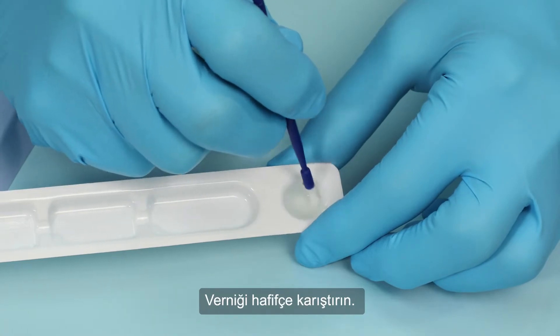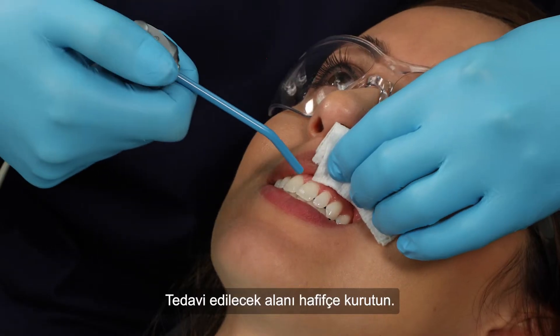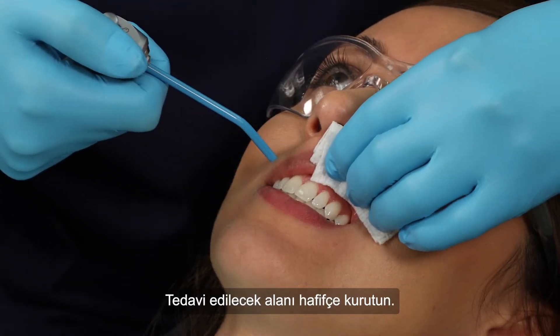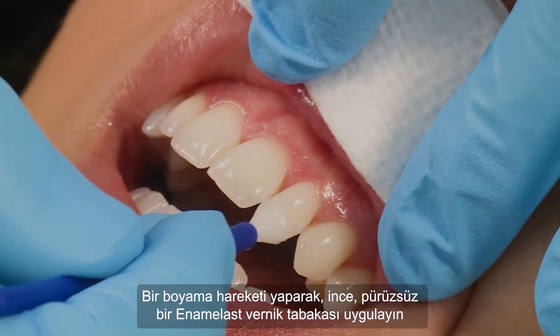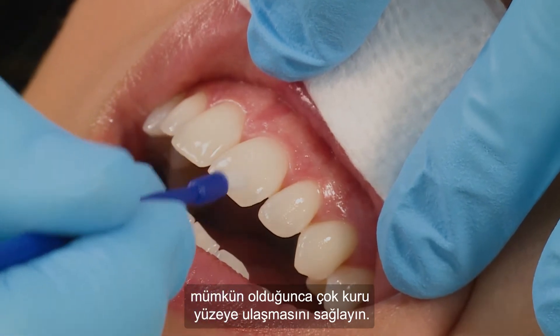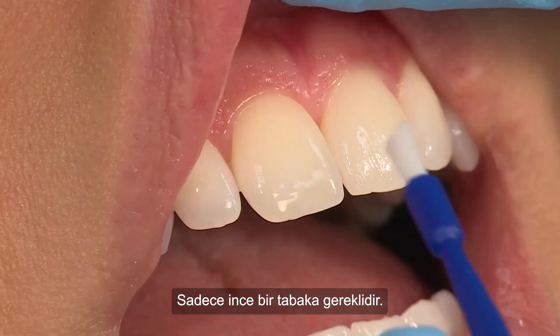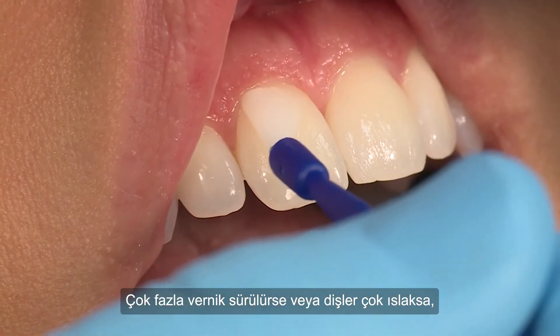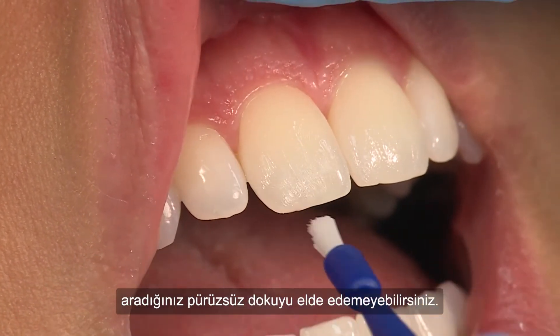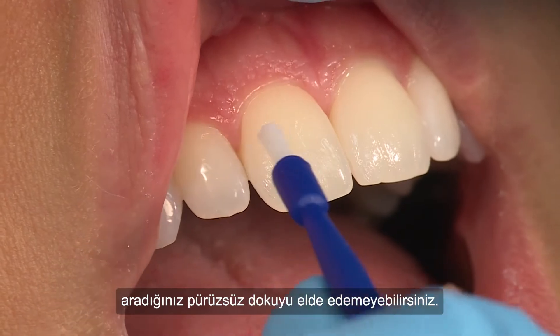Lightly stir the varnish. Lightly dry the area to be treated. Using a painting motion, apply a thin, smooth layer of Enamel Last Varnish to as many dry surfaces as possible. Only a thin layer is needed. If too much varnish is applied or teeth are too wet, you may not get the smooth texture you are looking for.